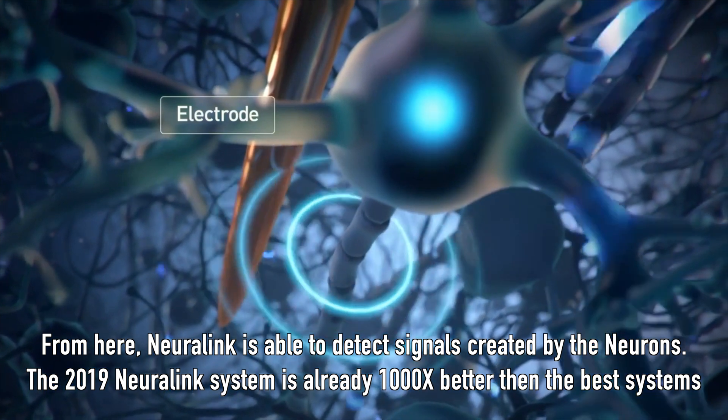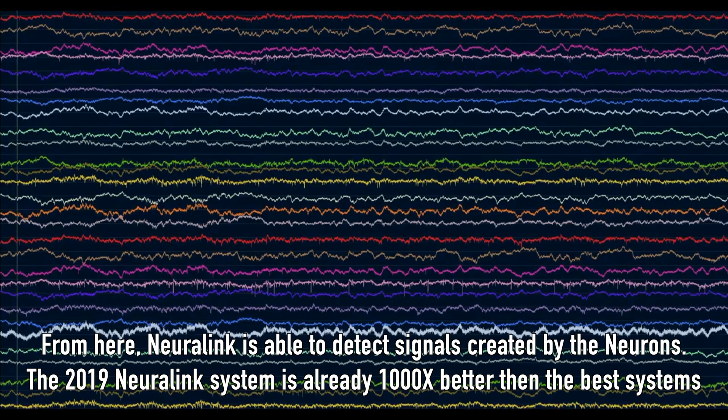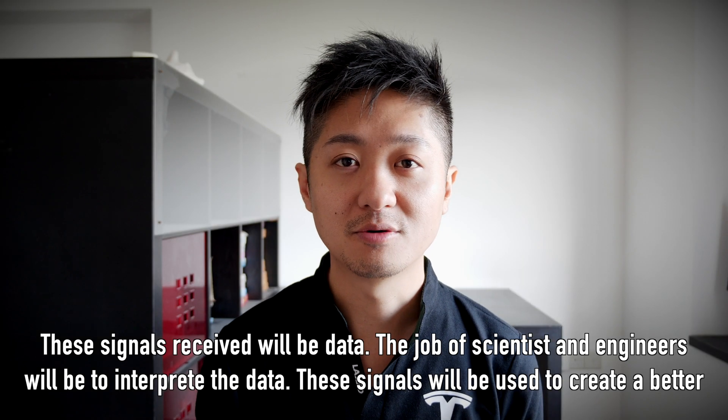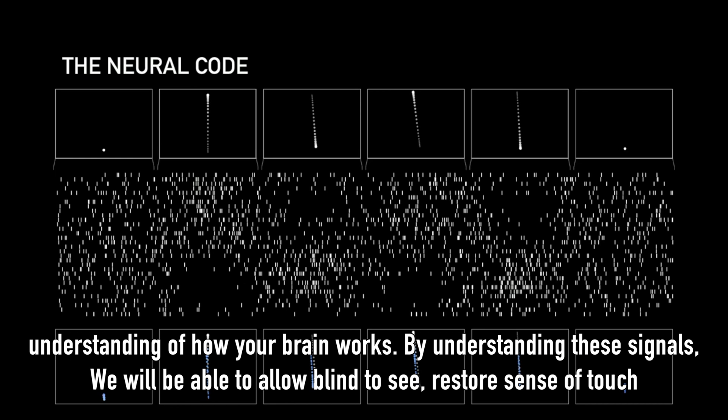Neuralink is able to detect signals created by the neuron. The 2019 Neuralink system is already a thousand times better than the best systems out there — for example, the electrode inserted in the head is so much smaller than the most advanced systems right now. These signals received will be data, and it's the job of scientists and engineers to understand the data received. These signals will be better used to understand how your brain works.